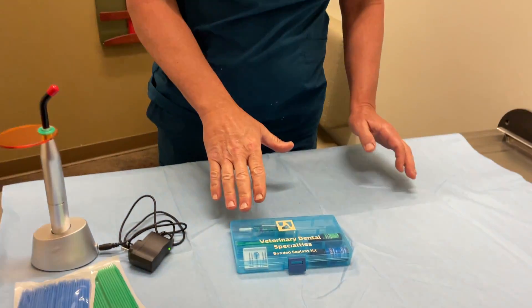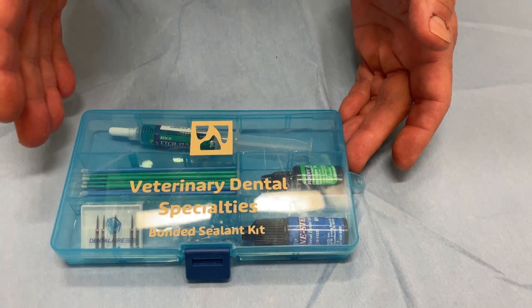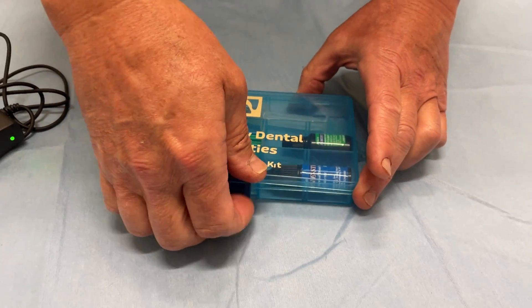So let's take a look at the actual kit. First of all, it comes in a nice small package here. Stores really, really well. When we open it up, you're going to find out what comes in here.